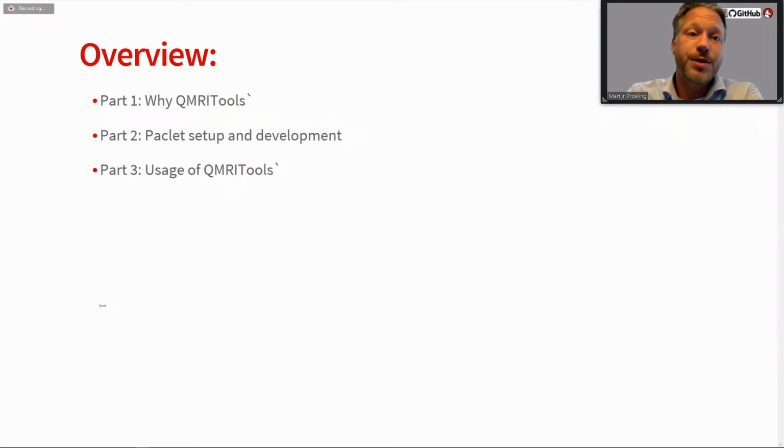So, a quick overview of the presentation, basically 3 parts. So why QMRITools, how it all started. I will discuss a bit how I set up my Paclet and how I use it in development. And then, of course, how I use it in my own research.